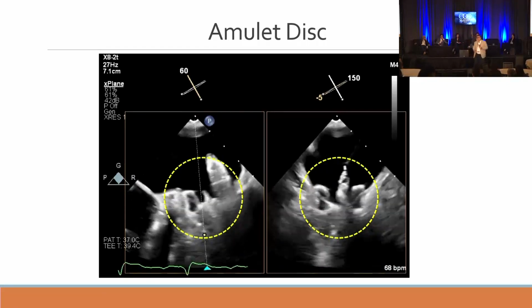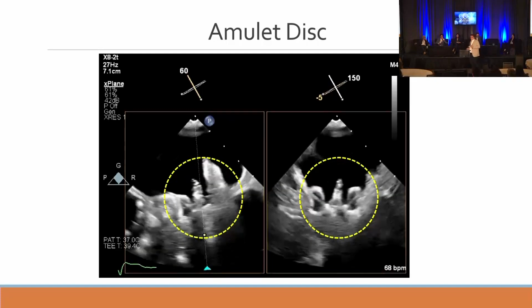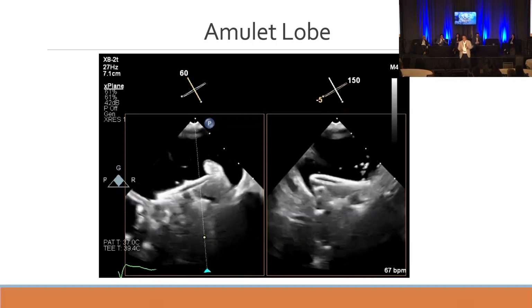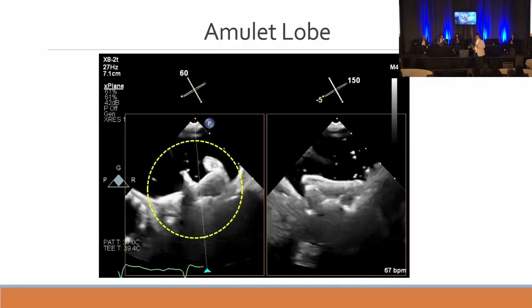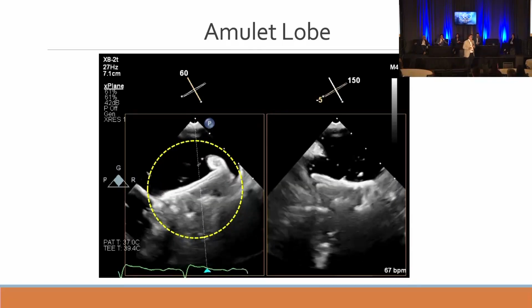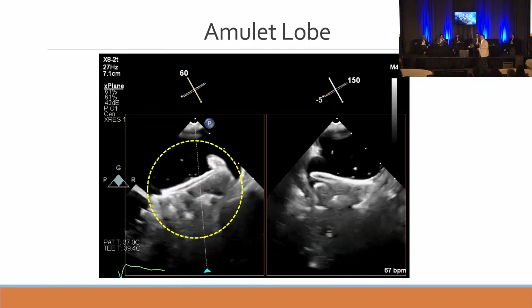Into the lobe. Now that's a lobe. We have decided, you already see that may not be, and then we deploy the disc. It's a challenge, huh? It's maybe not completely optimal. So at first in the low angle, you see that the disc is not above the Coumadin ridge. It's pushing on the pulmonary vein lobe.